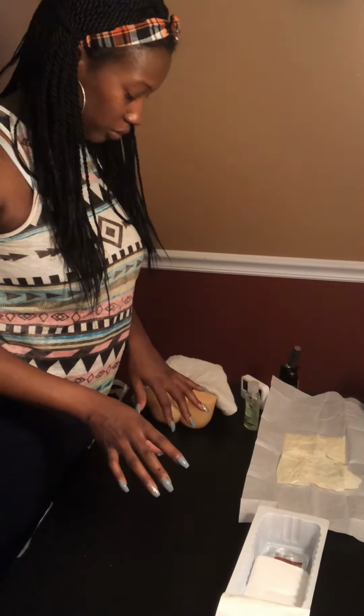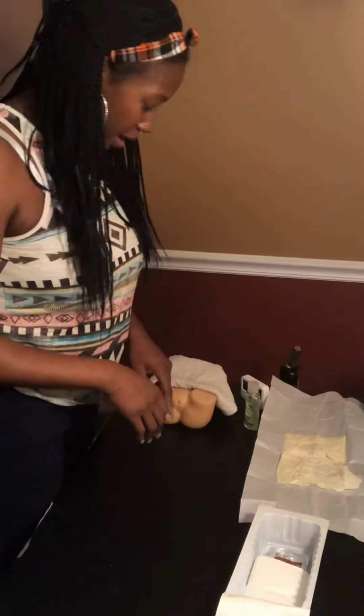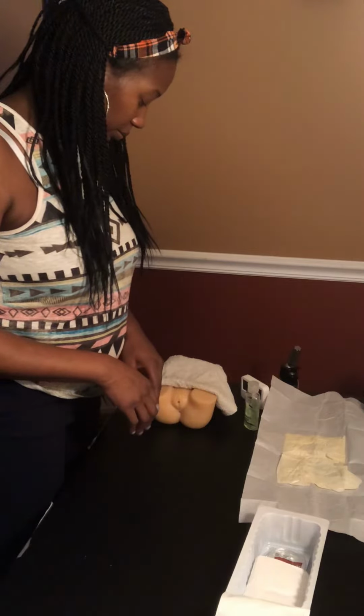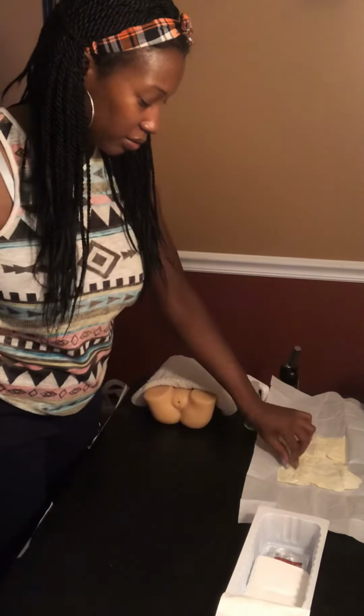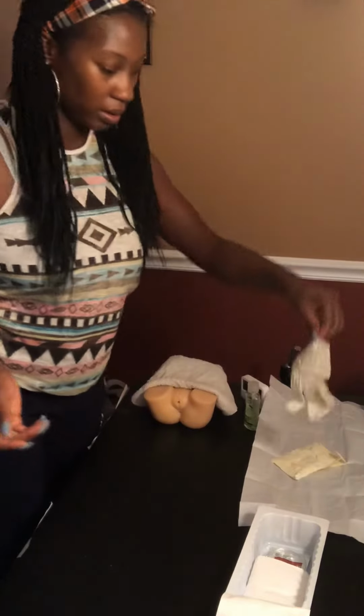So I'm going to don my gloves. I have to be on the right hand side though. But I am on the right hand side. So this is the patient right hand side. I'm right handed. And that's so I can use my non-dominant hand to hold open the vagina. So don my gloves, sterile gloves. Grab it by the cuff.